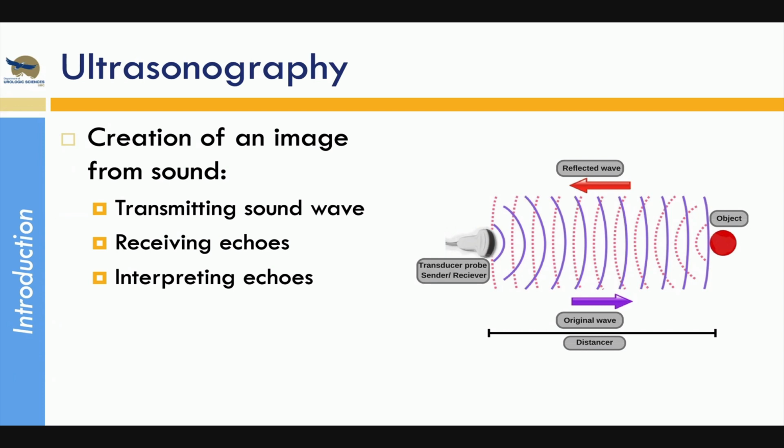These ultrasound waves echo off tissues, and different tissues have different densities or acoustical impedances. These tissues have differential refraction and reflection properties. And these sound waves that are scattered and absorbed differentially are returned to the probe, which then detects the echo and displays them as an ultrasonic image.